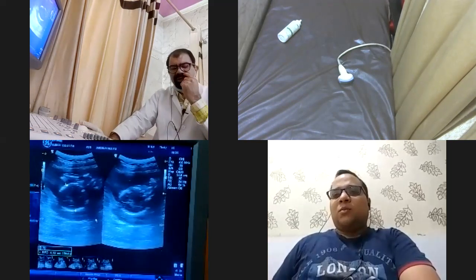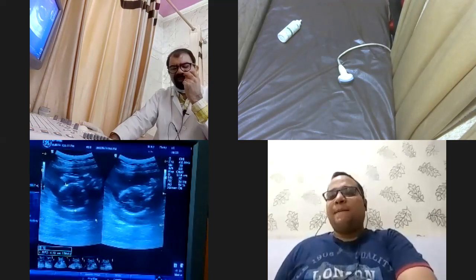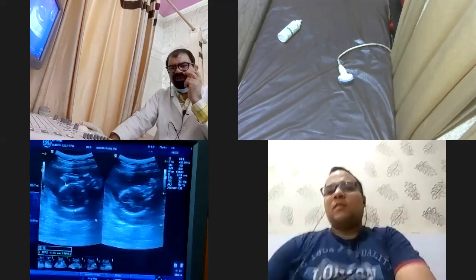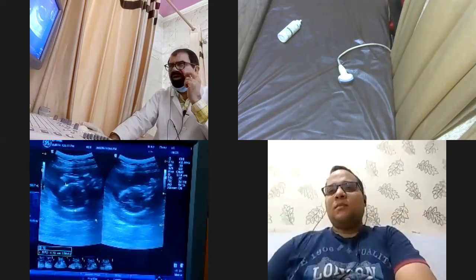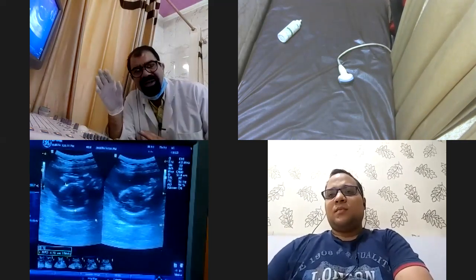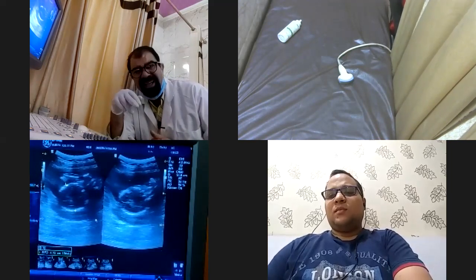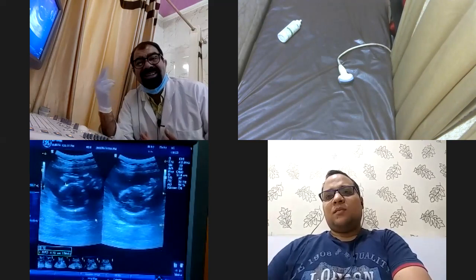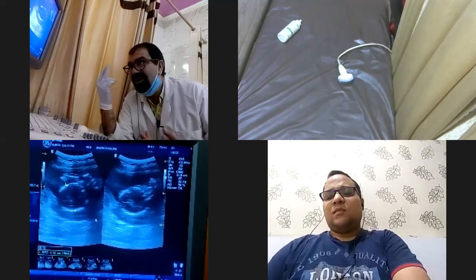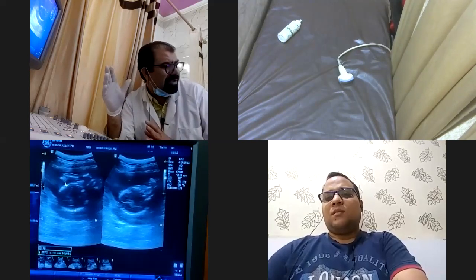I got your point, the coronal section. Let me elaborate your question, and you will tell me whether I have got your question rightly or not. What you are thinking is that this posterior is with respect to the body or the area, whatever I am scanning. Have I got your question rightly?